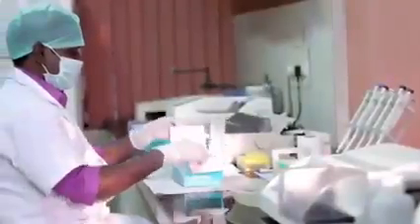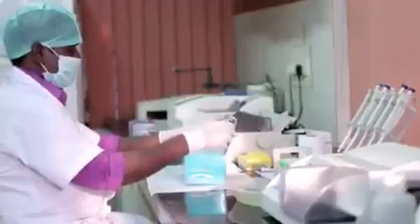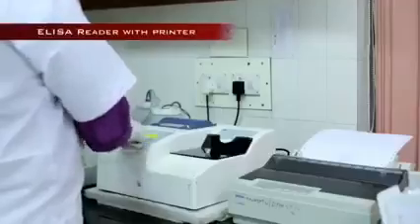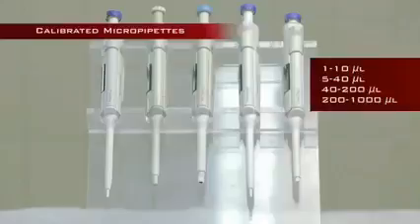ELISA procedure. First, let us list out and describe the equipment, reagents and basic requisites required to perform the ELISA procedure. Equipment: ELISA washer, ELISA reader with printer, incubator, calibrated micropipettes 1 to 10 microliters, 5 to 40 microliters, 40 to 200 microliters, 200 to 1000 microliters, tabletop centrifuge.